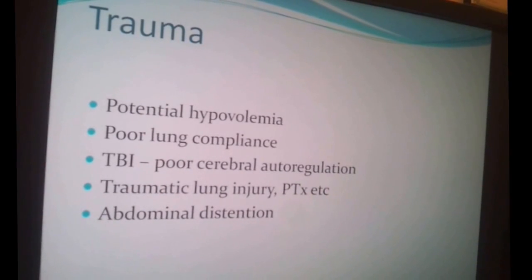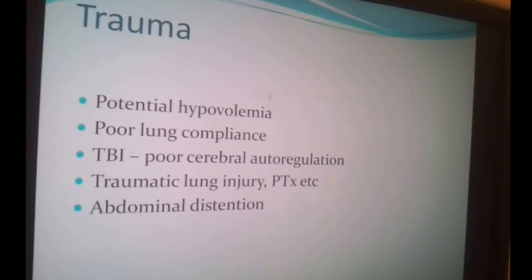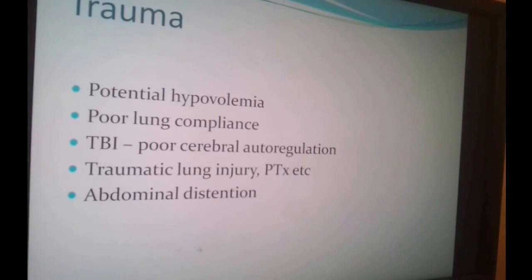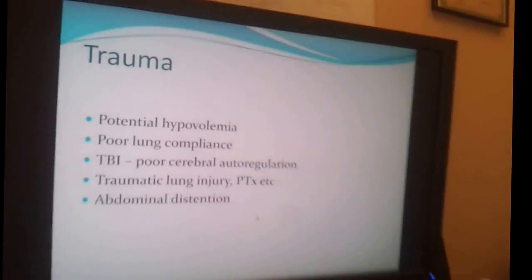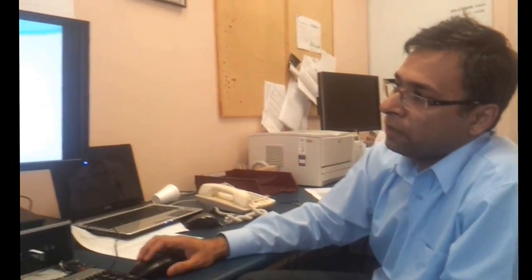Trauma is a hugely difficult problem which involves hemodynamics, lungs, brain, tummy, all working against you and all limiting your potential to play with the ventilator. Okay, we'll go through them one by one.